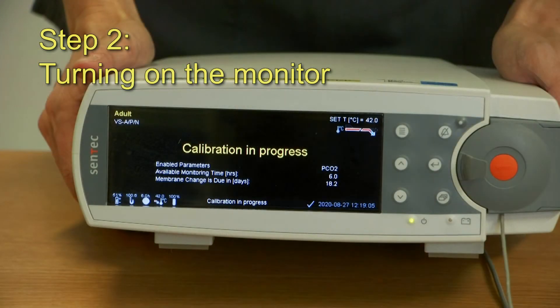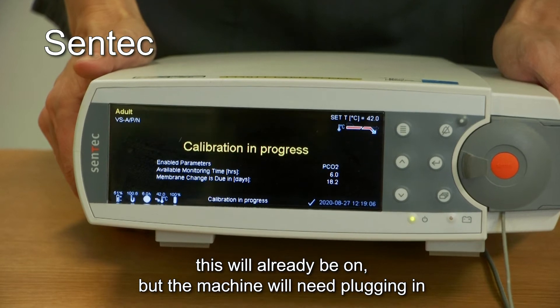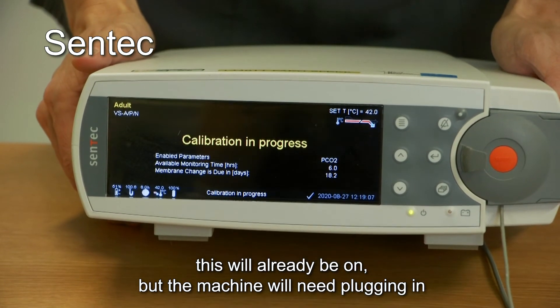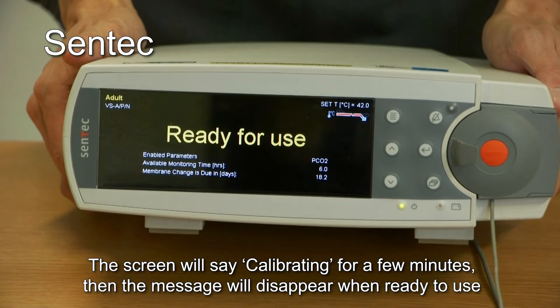Step 2. Turn on the monitor. If using the Centec, this will already be on but the machine will need plugging in. The screen will say calibrating for a few minutes, then the message will disappear when ready to use.